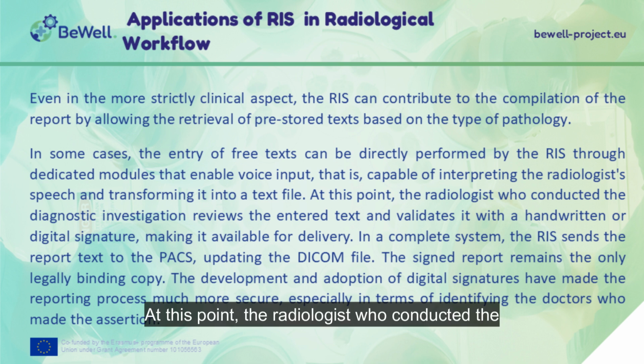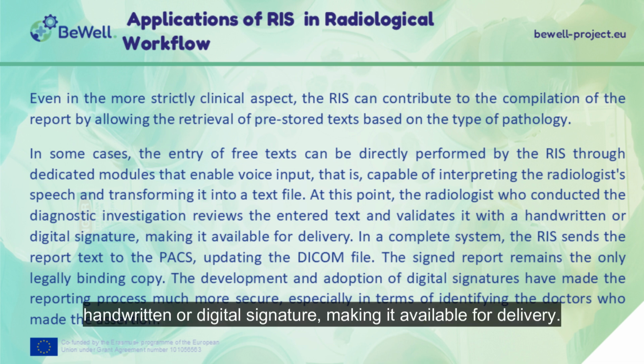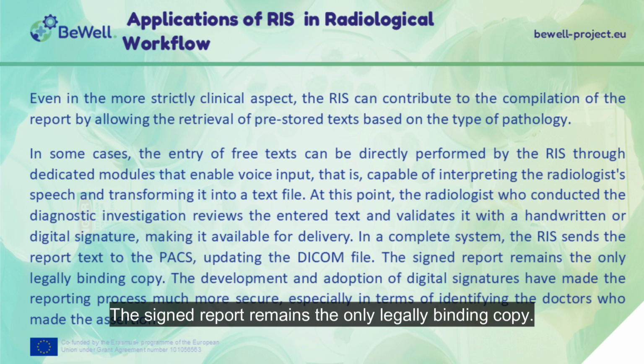At this point, the radiologist who conducted the diagnostic investigation reviews the entered text and validates it with a handwritten or digital signature, making it available for delivery. In a complete system, the RIS sends the report text to the PACS, updating the DICOM file. The signed report remains the only legally binding copy.